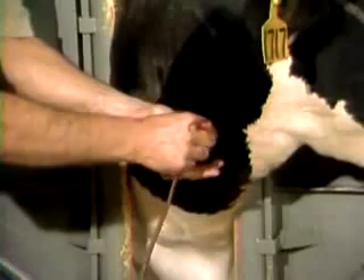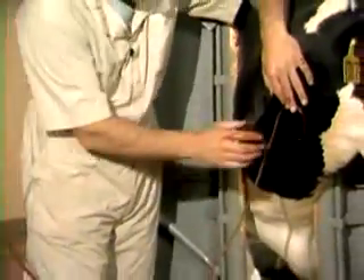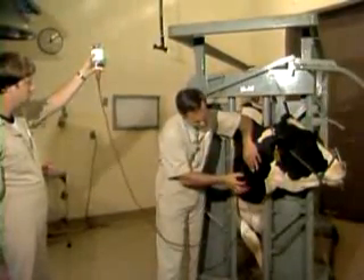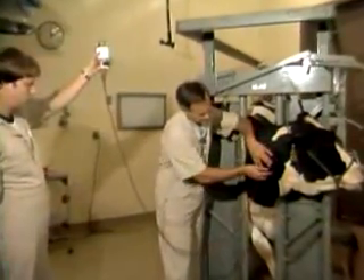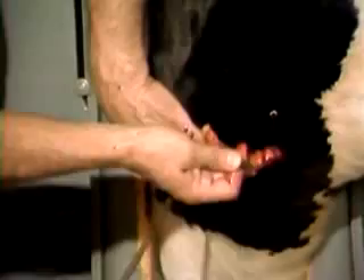Now we can safely administer medication by gently holding the hub, taking the adapter of the simplex, attaching it on there very gently without moving the needle, holding it at a position somewhat distant to the needle, and then we can see the medication go in. The reason for holding it up here is that if you hold the shaft of the needle, every time she jumps you risk changing the position of the needle — it might be outside, and you'd end up with paravascular medication. We can check this periodically by gently slipping down, grasping the needle, detaching, and holding off the vein to see if blood continues to pour out. That indicates that the needle is definitely in the vein.